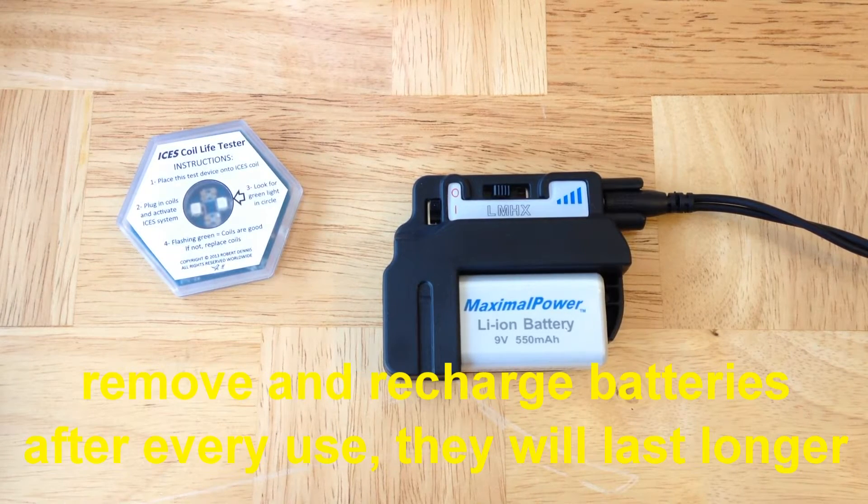Never leave batteries in the pulse generator when it's not being used. Always remove the batteries and, if rechargeable, recharge them for the next use. This will make your rechargeable batteries last a lot longer.